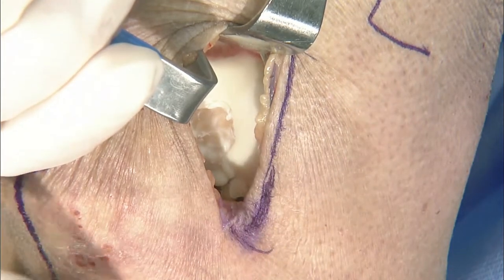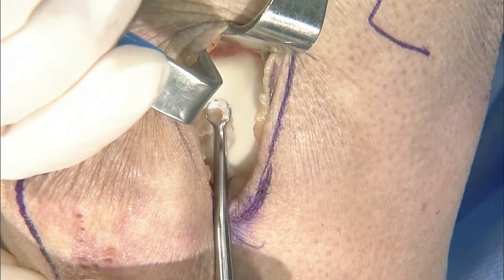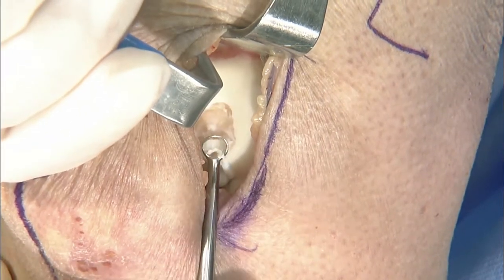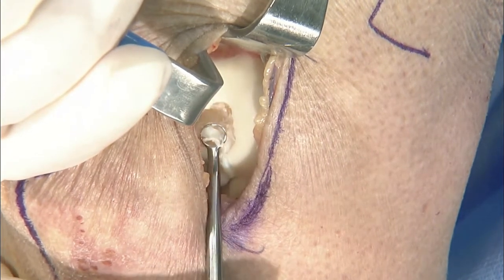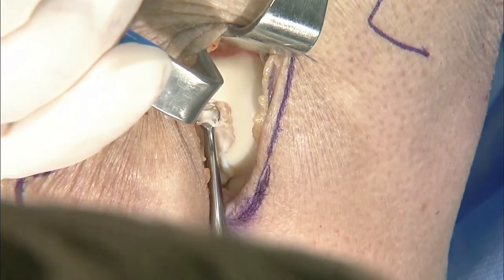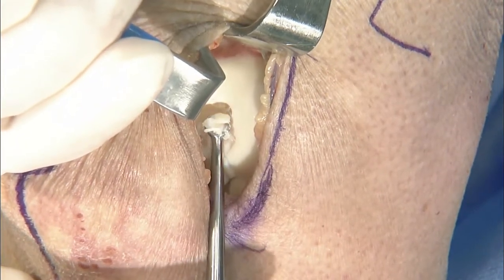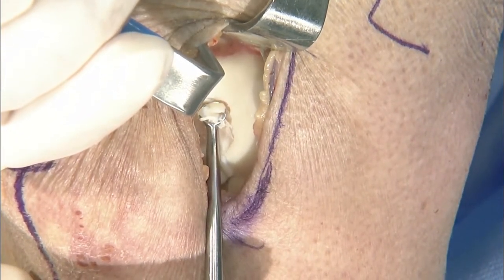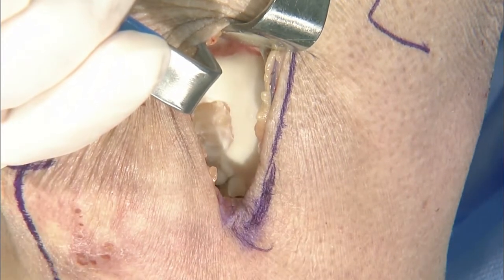I then come in right on top of that line right there, and it's a pretty hard push down and a pull into the defect there. And then go right next to it, push down and pull into the defect. So the goal is the quicker you can create these vertical walls, the better off that you're going to be, and the better the defect prep is going to be.